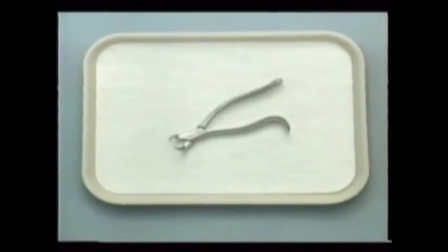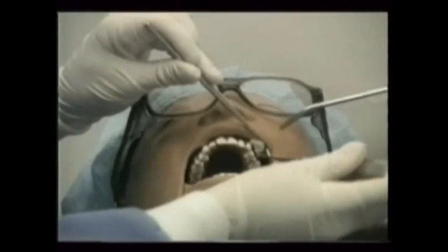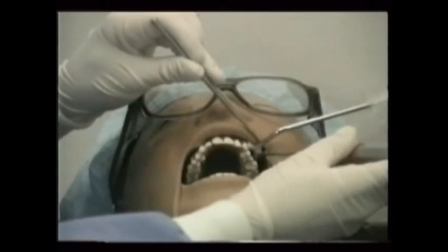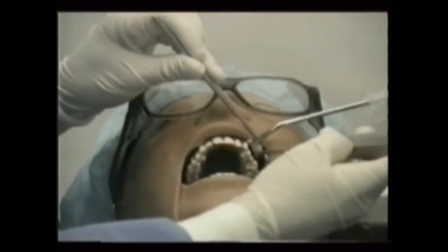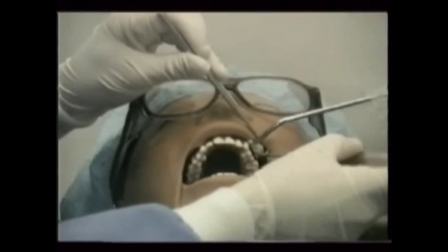Next, and quite contrary to what most people think, the majority of the extraction process takes place not with the extraction forceps, or pliers as patients call them, but with a tooth elevator. This instrument is placed beside the tooth and used like a lever, loosening and releasing the tooth from the thousands of small ligaments that anchor it in its socket. Its handle is designed to give the doctor a comfortable, secure grip.